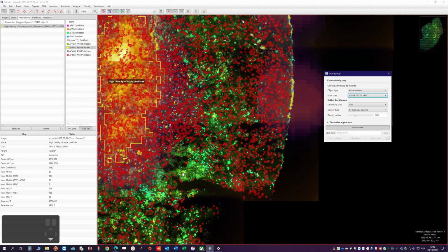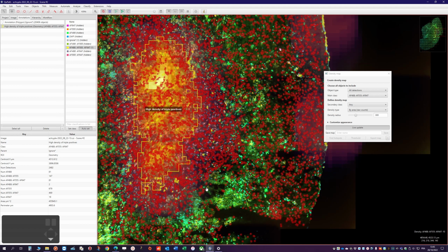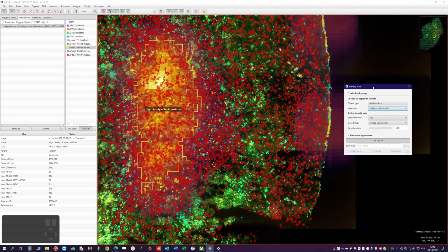So I've already done a video on this topic, so I thought that I would spice things up a little by adding density maps to the mix, and also something that I consider a bit more important, which is how to properly train your models using the most unbiased way possible, or at least as unbiased as possible. So this is the result you should get at the end of this video.